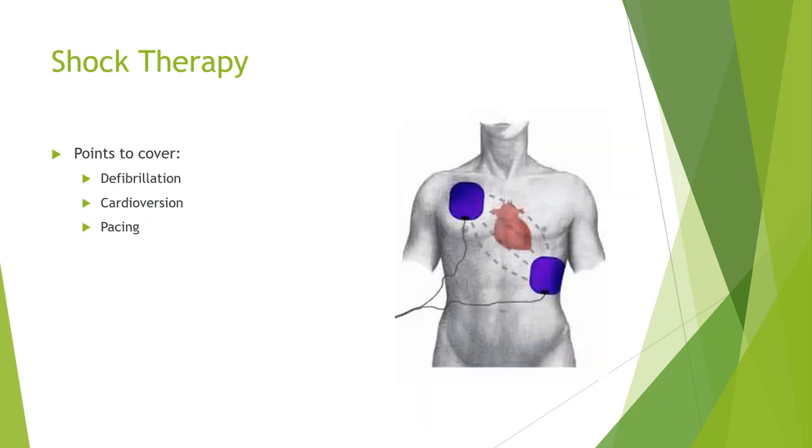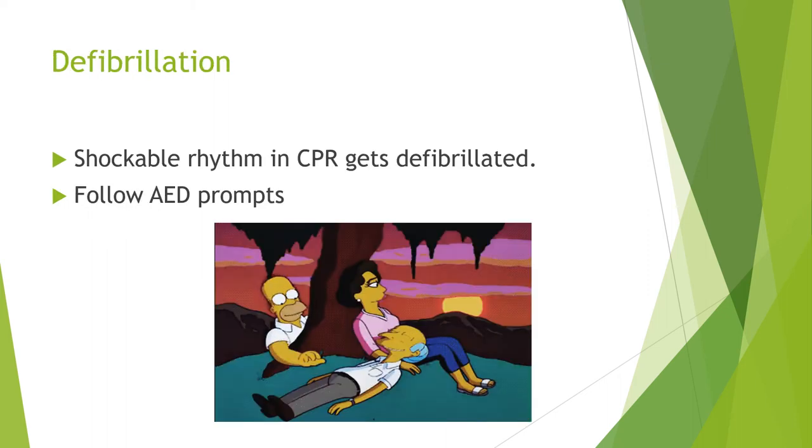Shock therapy or electrotherapy. Points we're going to cover are defibrillation, cardioversion, and pacing. Defibrillation. This sequence is structured around 2-minute periods of CPR during which the rest of the team should be preparing for the next step in the process.